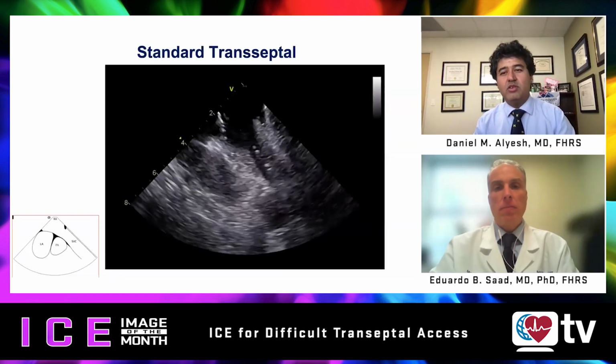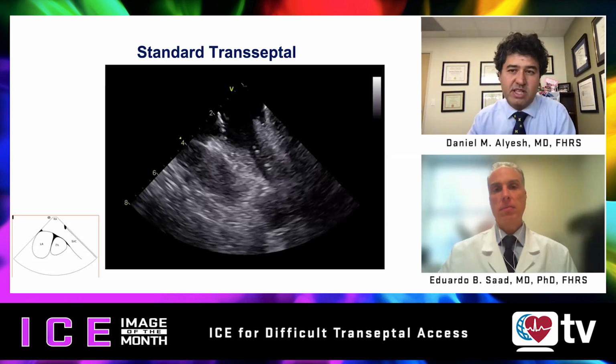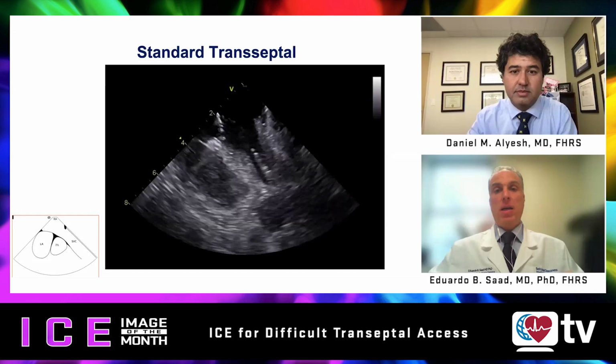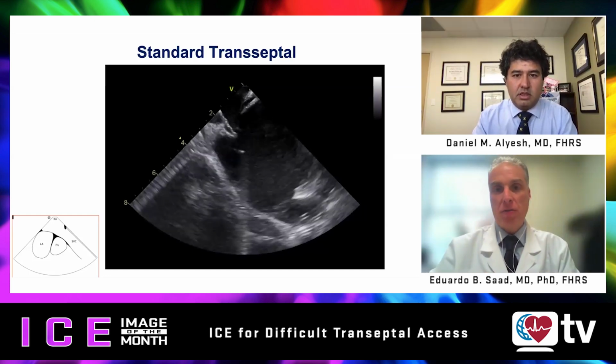So I think foundationally, we're going to start off with the standard transseptal and then get to the more advanced or difficult septa. So I'll have you narrate your transseptal here. Okay, so this is a standard transseptal access, no special issues about it.